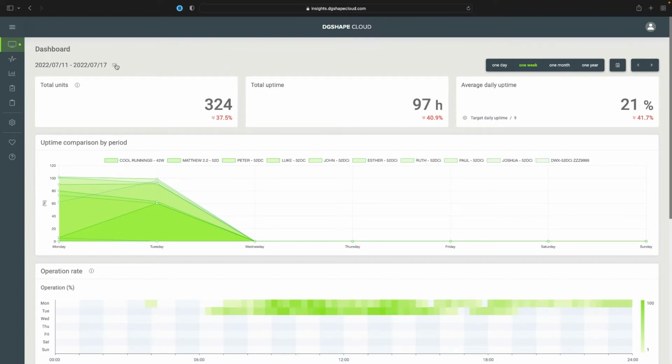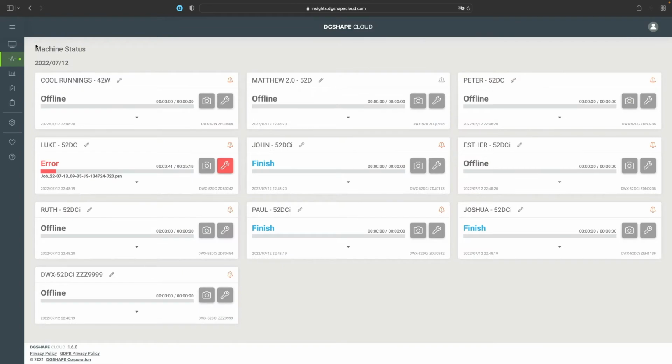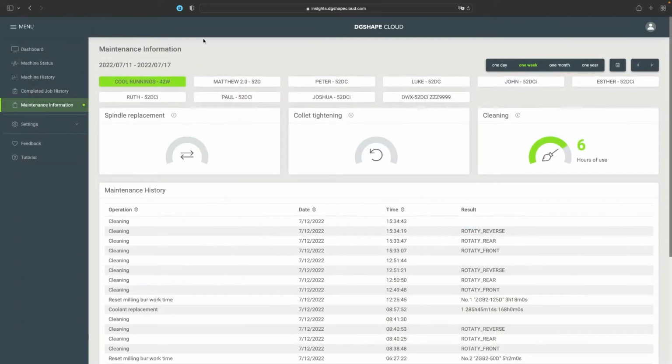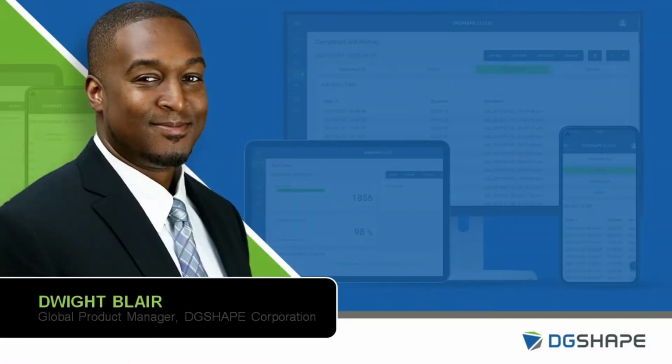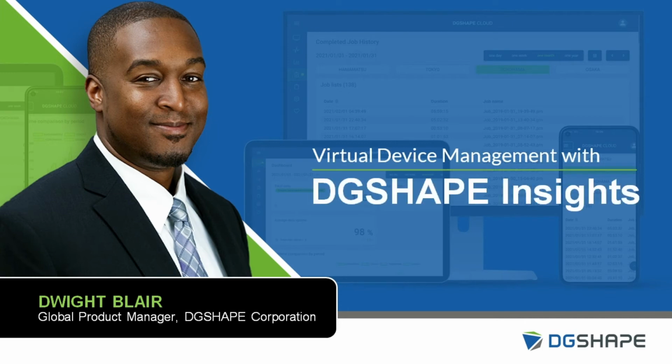That's why I'm here to introduce DGSHAPE Insights, a cloud-based web application that provides next-level support and monitoring features for all DWX users. Hi, I'm Dwight Blair, Global Product Manager for DGSHAPE Corporation. I test, support, and promote DGSHAPE products, and I teach digital workflows for the dental industry.